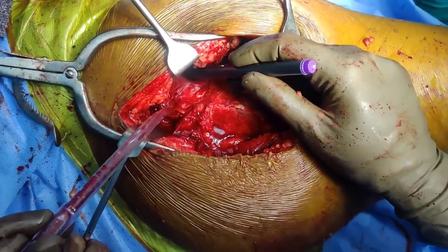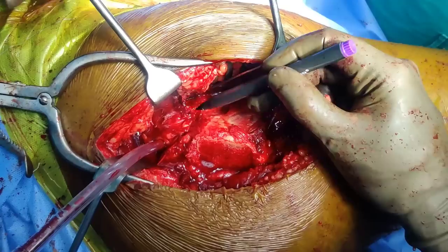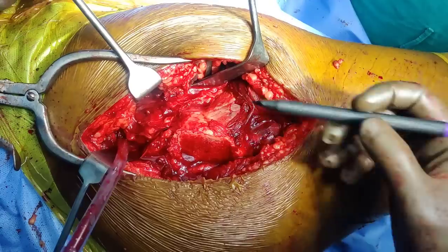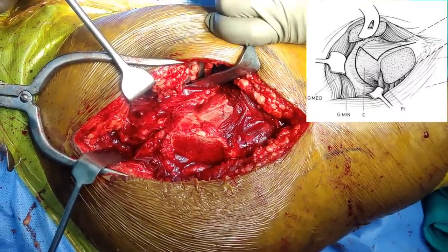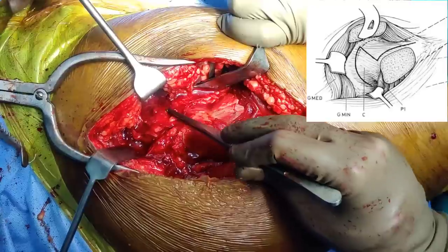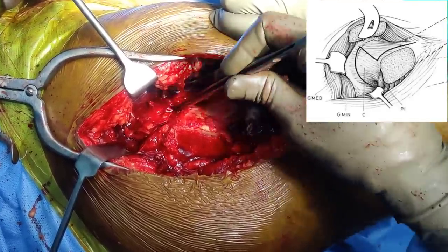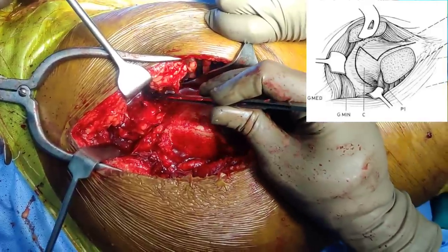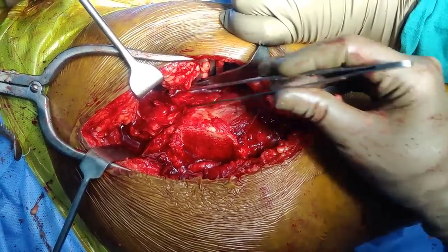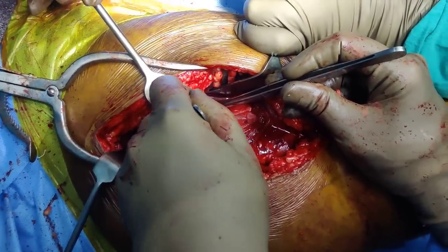The first limb of the capsulotomy will be the vertical capsulotomy in the center. The second limb will be going inferiorly, and the third limb will be going superiorly. When you open the capsule: the first limb goes in this direction, the second limb starts from the inferior aspect going inferiorly, and the third limb goes from the superior aspect across in this direction. One thing you must be very careful about is not damaging the labrum.